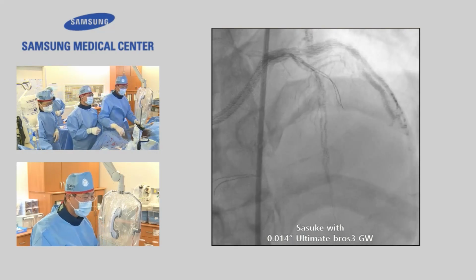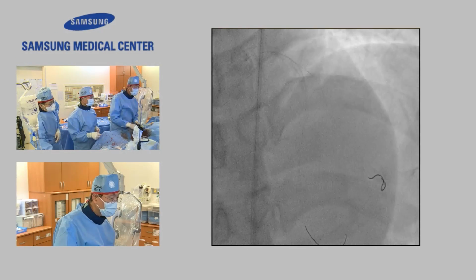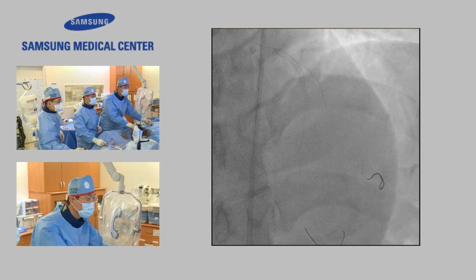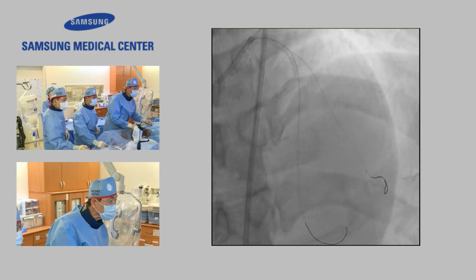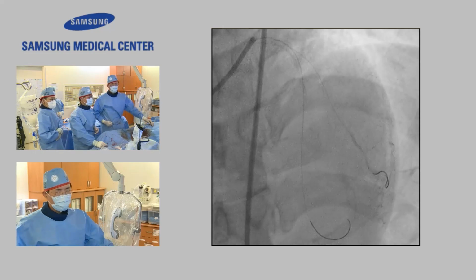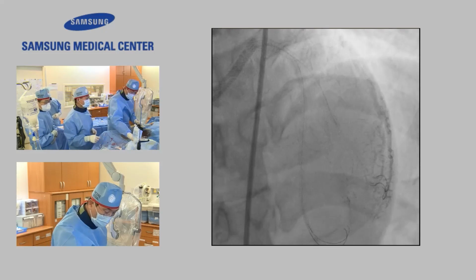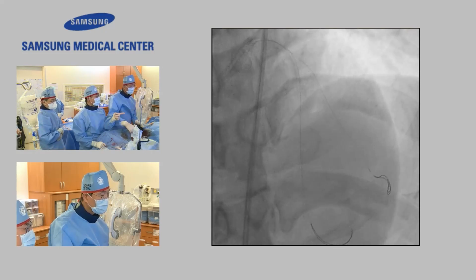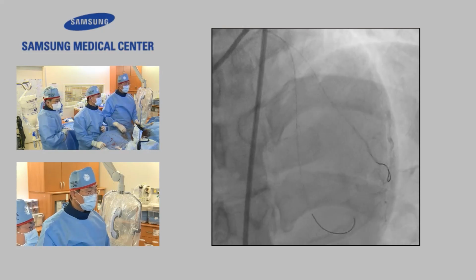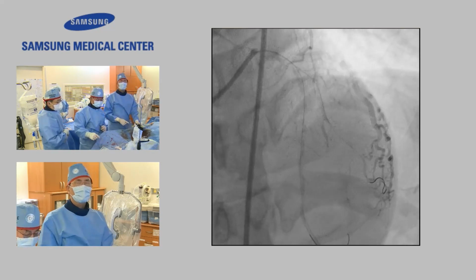Anyway, let's check again. Angiography. So this is inside of diagonal. Anyway, distally it's a true lumen. So I think we can dilate. But in this angiogram, the wire is positioned in the true lumen all the way. All the way. Yeah, we just saw the tiny branches. Okay.